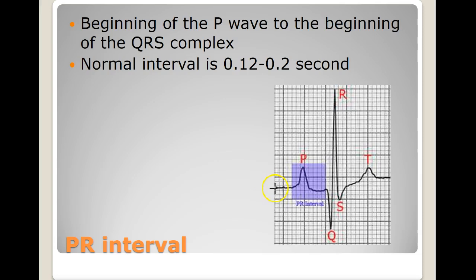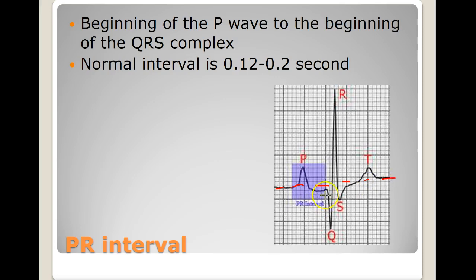There's something else I want to establish: the isoelectric line. ISO means 'same electric line.' There are deflections because of the electrical activity of the heart, and the EKG machine captures these. The P wave is a positive deflection. The first negative deflection below the isoelectric line is the Q wave. The Q starts from the isoelectric line, deflects negatively, and returns to it. Not every QRS complex contains a Q.